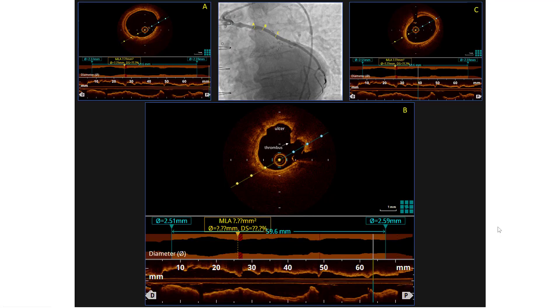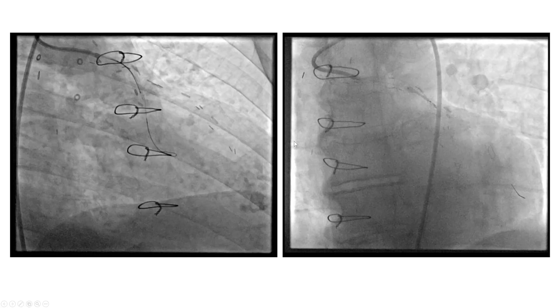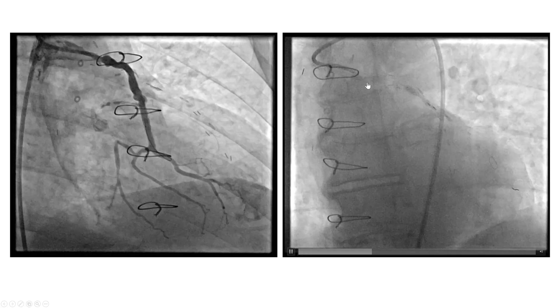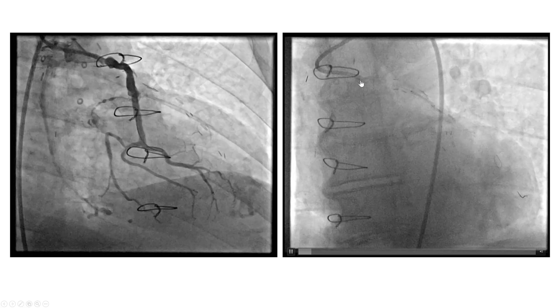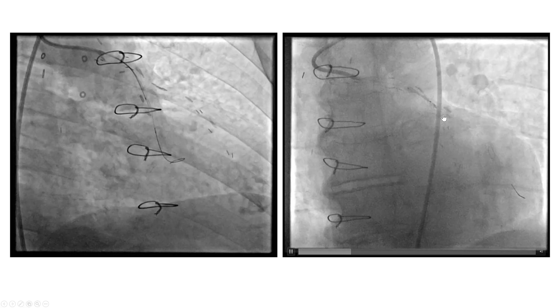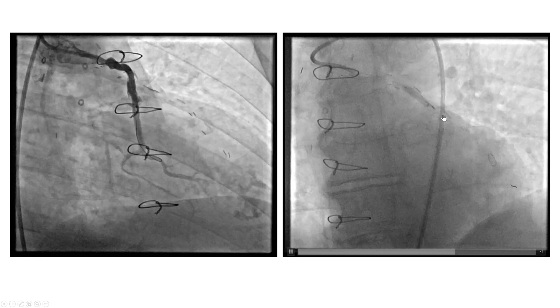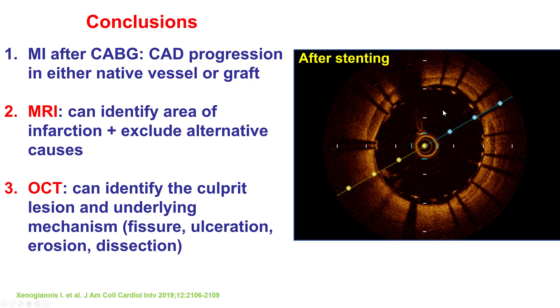As a result, we went back and did optical coherence tomography of the SVG to the obtuse marginal branch. And indeed, we found an area of ulceration and thrombus in the SVG that was subsequently stented using a drug-eluting stent. This provided a nice result, and the patient did not have any recurrent symptoms.